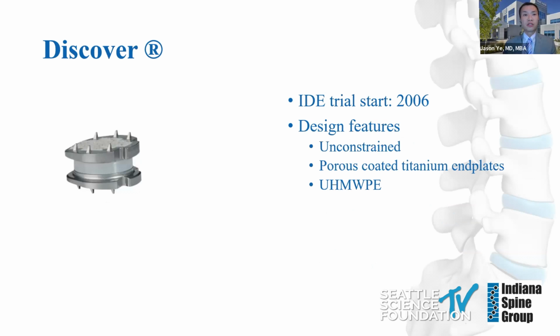The Discover disc entered trials in 2006. While preliminary results of the US IDE trials were promising, studies coming from Sweden and Norway showed a higher index level reoperation rate in the arthroplasty group and no significant benefits versus ACDF in terms of outcomes. This disc was never approved in the United States.